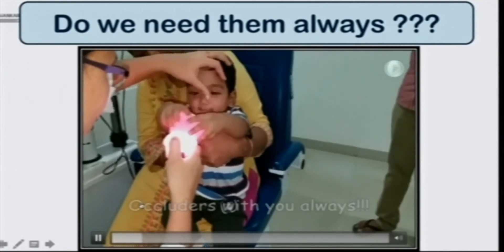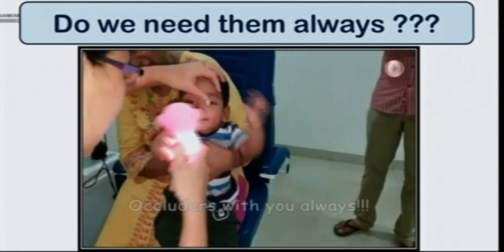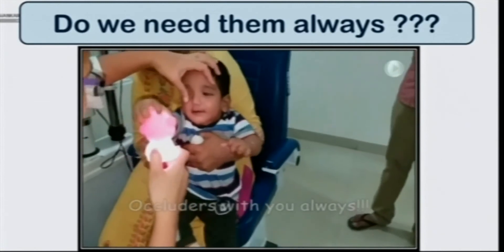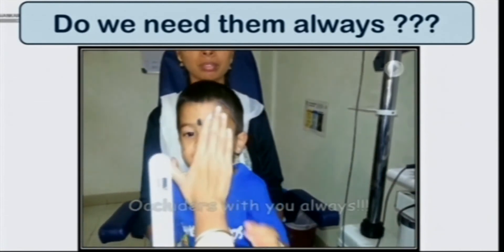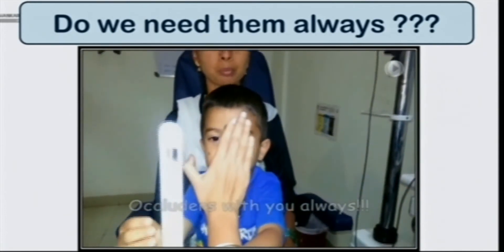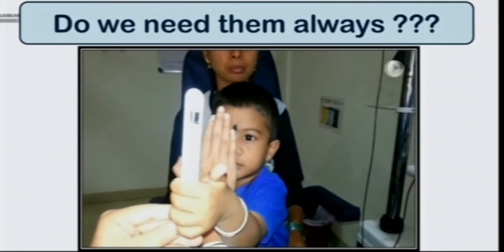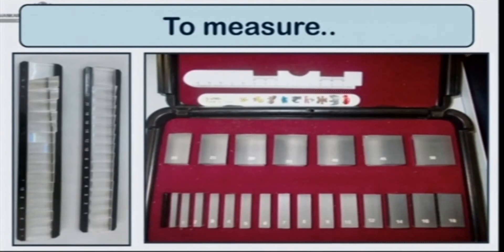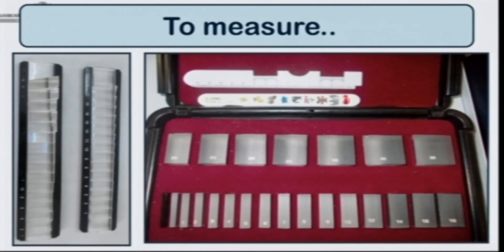In very young infants, they usually get offended by occluders because we are introducing another object in front of the child's eye. So we could use our thumb in infants, or our palm in slightly older children, to measure the squint. Once we confirm the presence of squint via fixation targets and occluder, we measure it with prisms — either loose prisms or a prism bar.